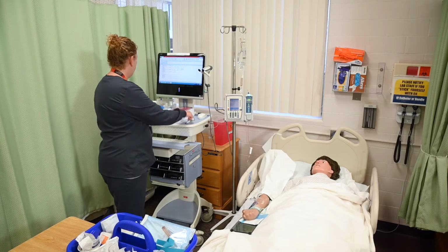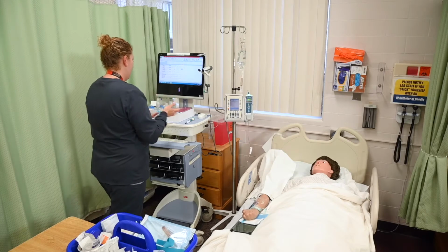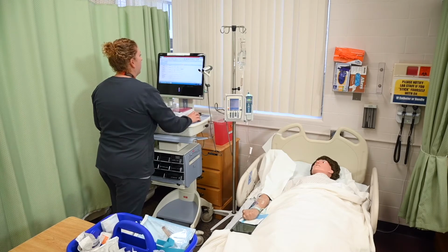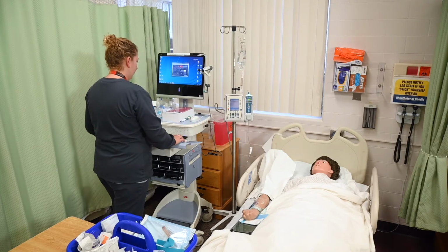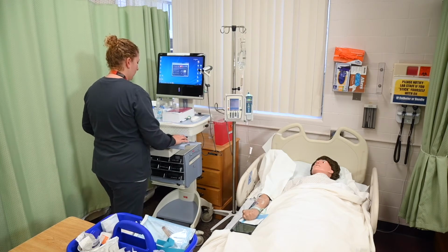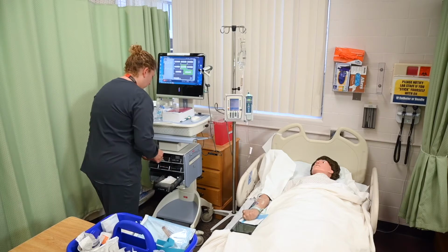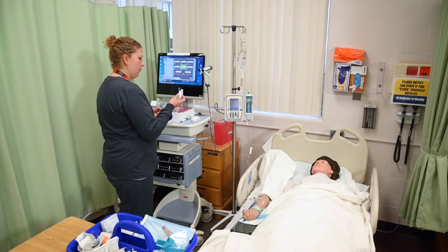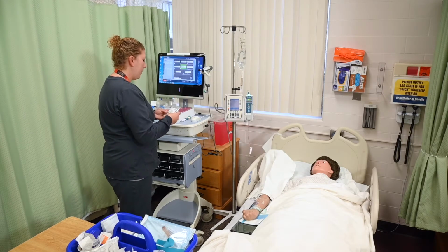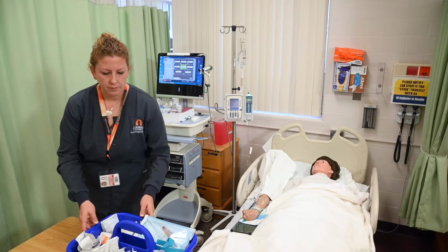Perform hand hygiene. Pull the medications and saline flushes and check expiration dates. I've pulled my medication and checked expiration date. Gather the necessary equipment and supplies.